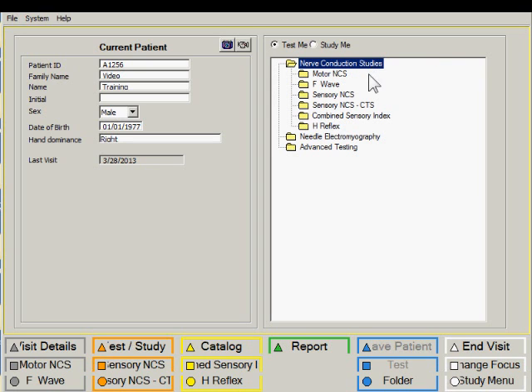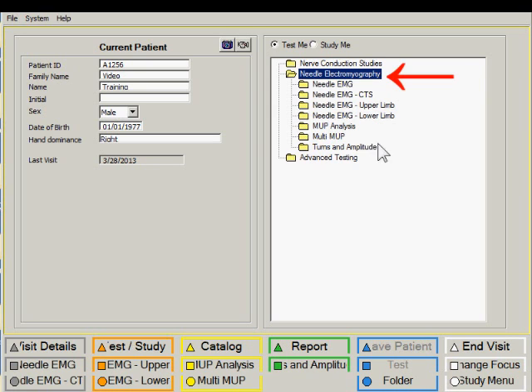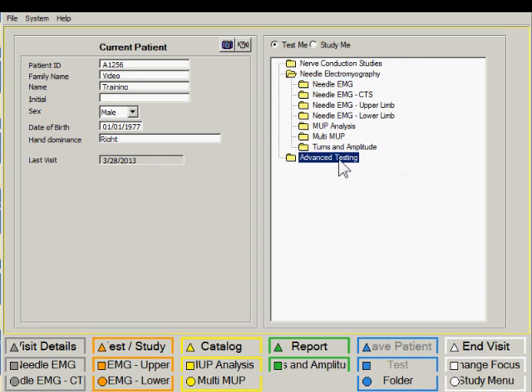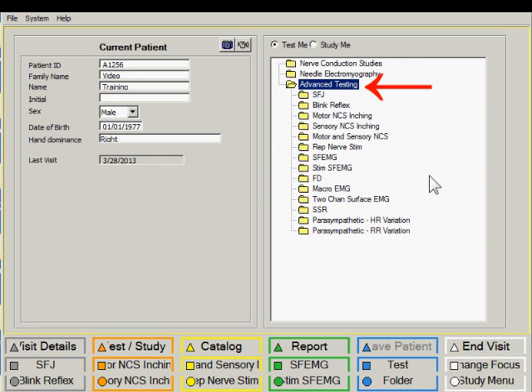Within this folder we have the motor nerve conduction, F-wave, sensory NCS, etc. We have another test folder that gives us access to needle EMG type studies and a third test folder that gives us some of the advanced testing capability or uncommon procedures.